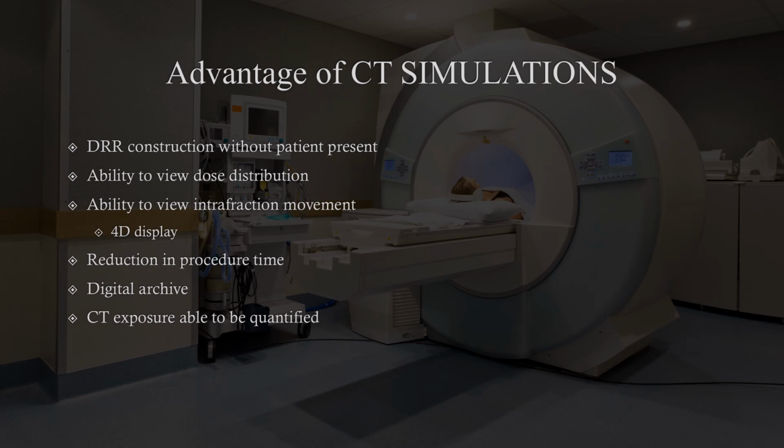Here are more advantages of the CT simulation. DRR construction without the patient present, where DRR stands for digital reconstructed radiograph, which helps to monitor the patient setup during treatment in the image guidance system. Ability to view the dose distribution, ability to view the intrafraction movement, which is the setup of the patient, 4D display, reduction in procedure time, digital archive, and CT exposure able to be quantified.